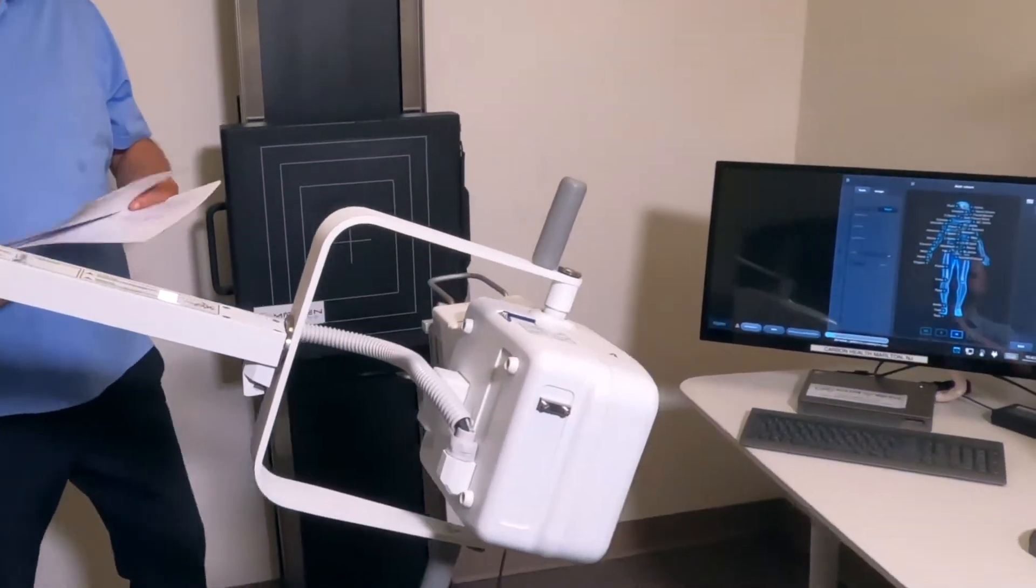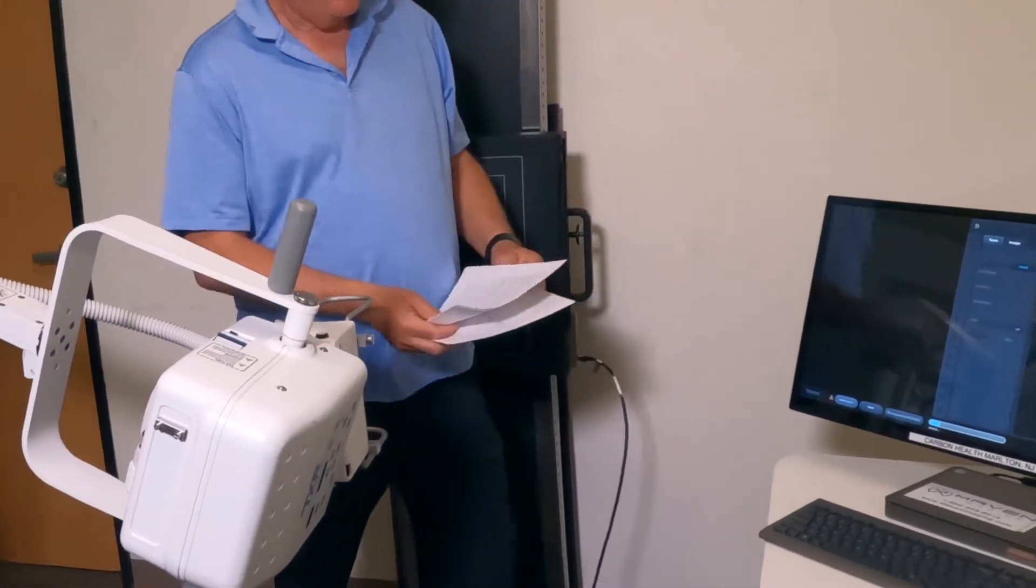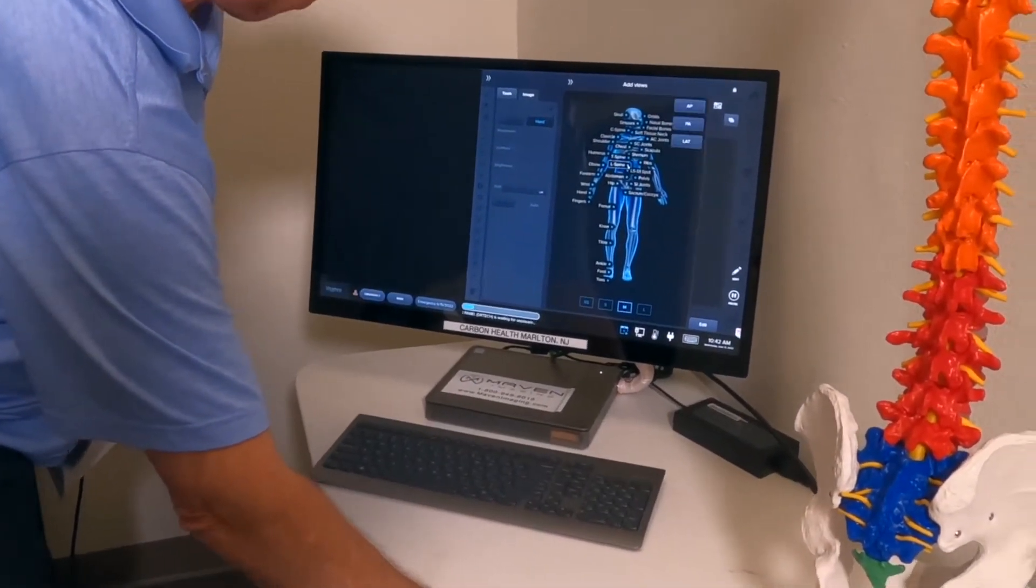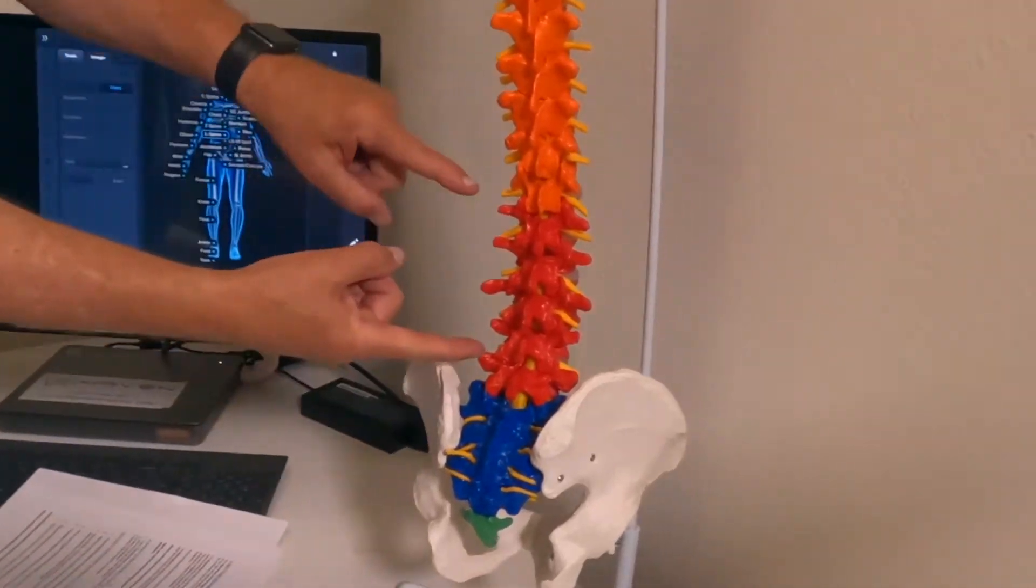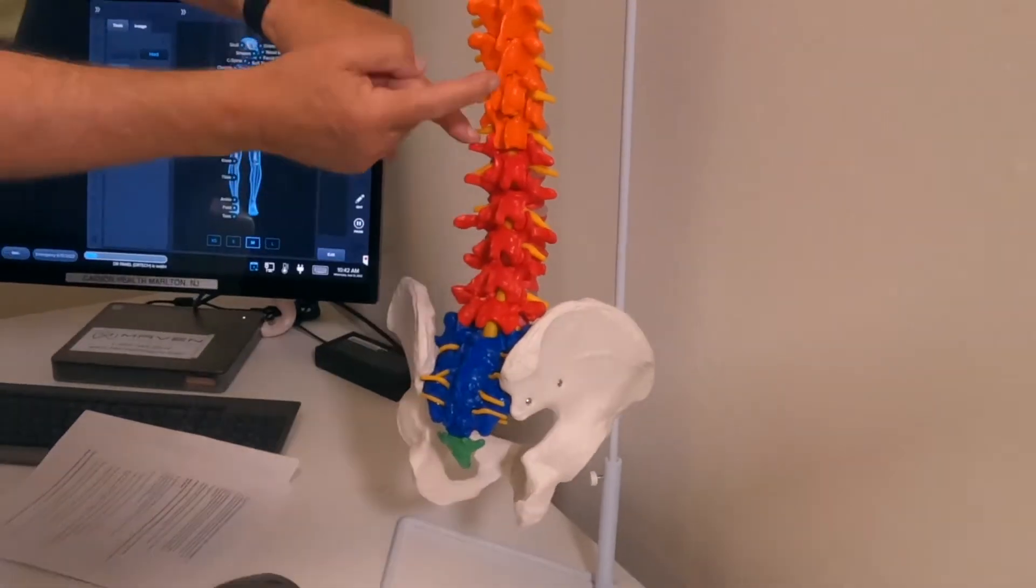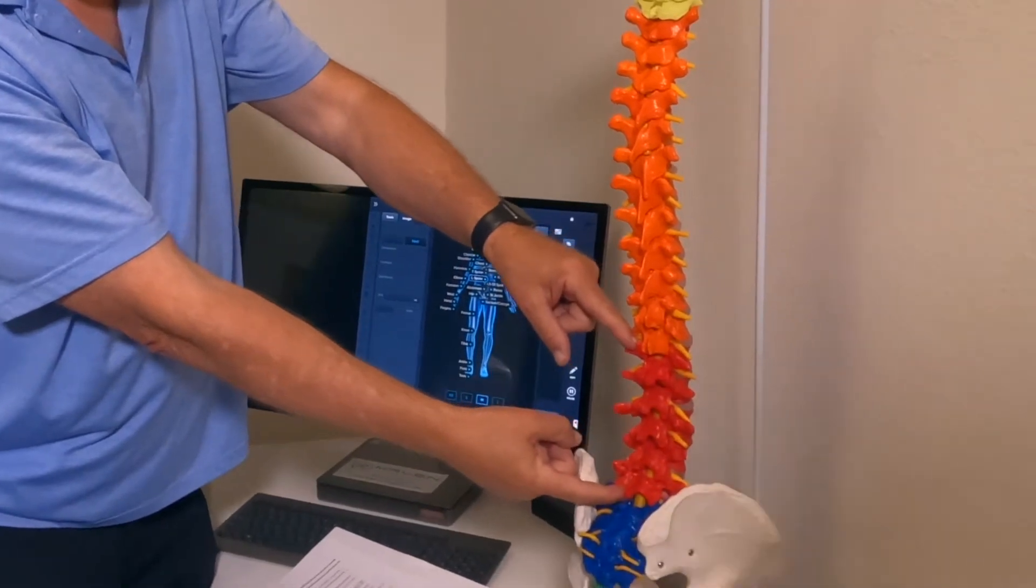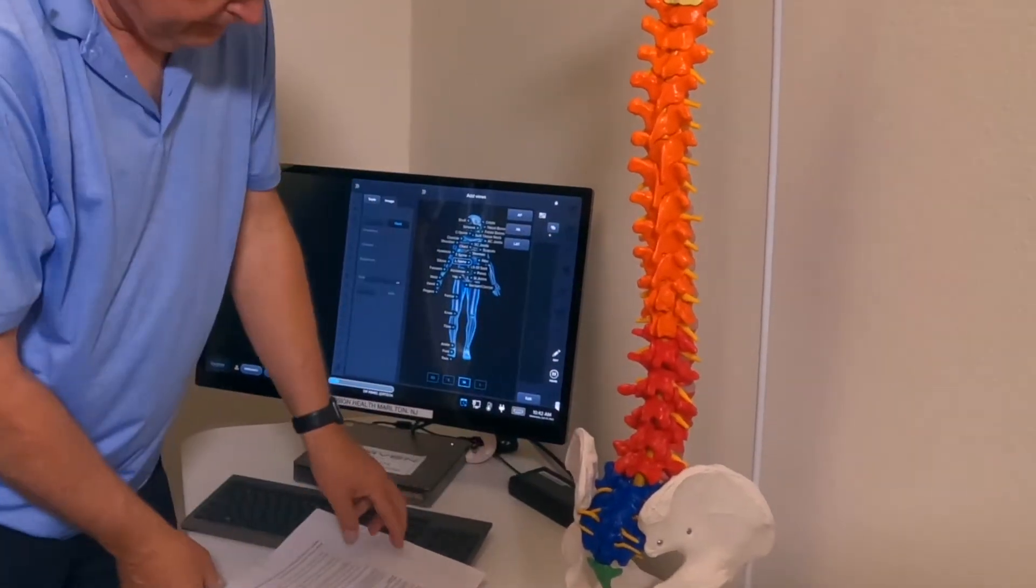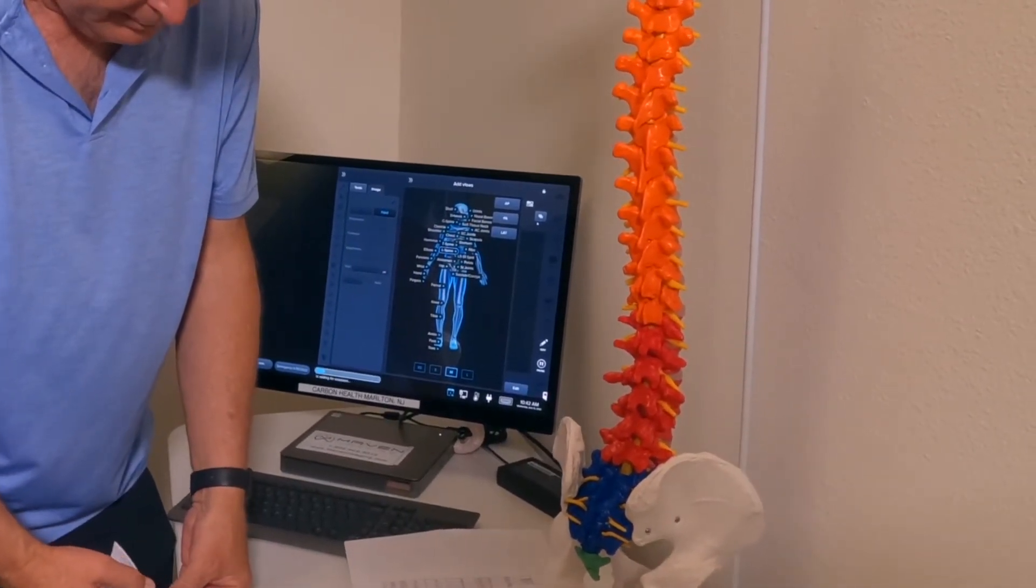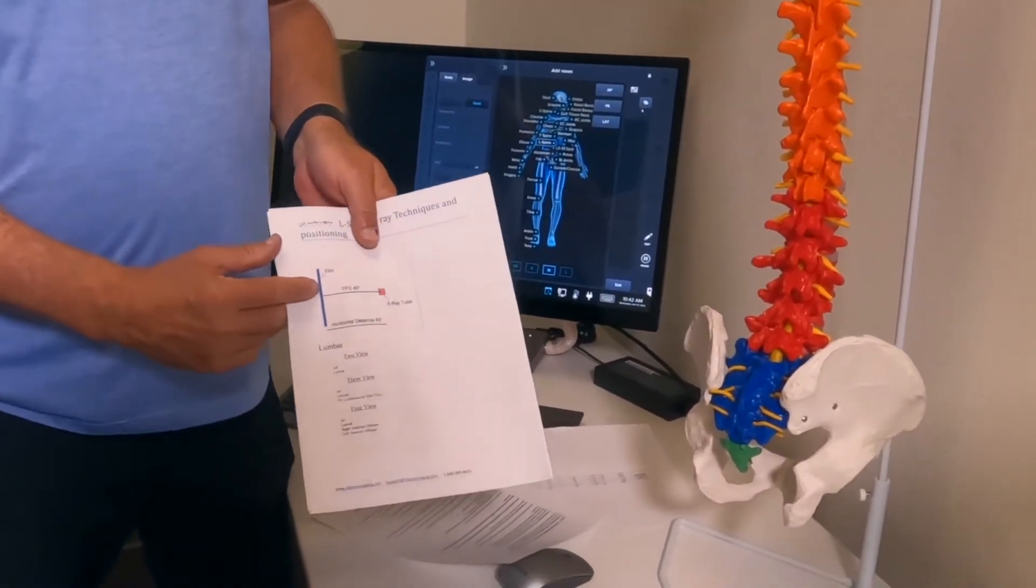Now we're going to select the L-spine. The L-spine is this part of the human spinal column. You have C-spine, T-spine, and L-spine. When you're shooting an x-ray for the L-spine and you're doing an AP shot, we have a little diagram that we're doing for you this morning.